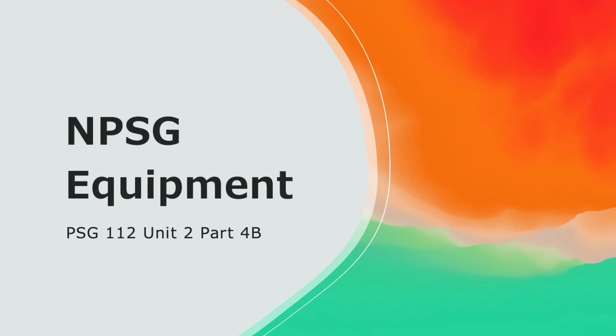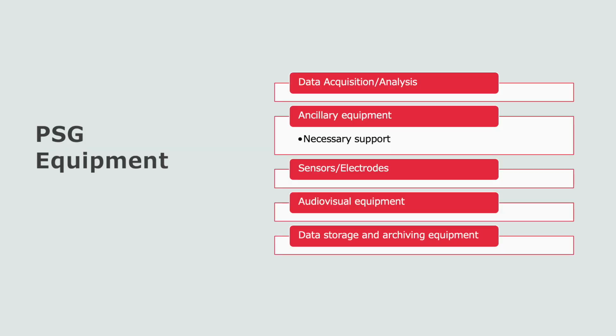Okay, welcome back. Let's talk about the equipment and supplies that we use for sleep studies. It's amazing to think about all the supplies and different kinds of equipment that you need. You need equipment that will record, monitor, and allow staging and scoring of the record. You need ancillary support like telephones, office computers, just for office things, maybe panic buttons, AED machines, and CPR backboards.